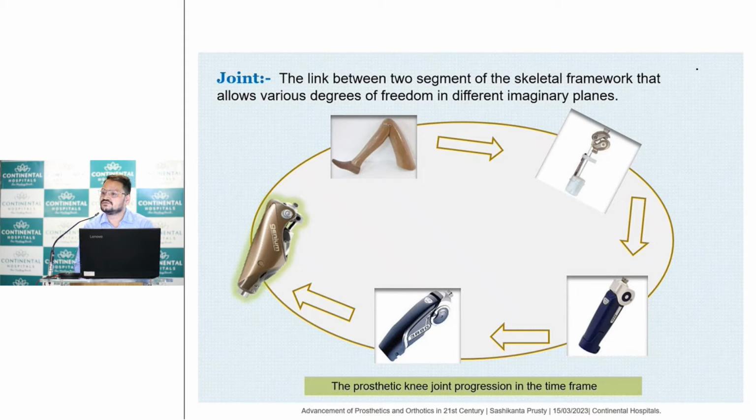We will analyze the patient's gait pattern, and as per the pattern, we will build it into the mobile, or we will give them a remote control. So from that, whatever functions they want, they can just switch it off, change the modes, and walk on.